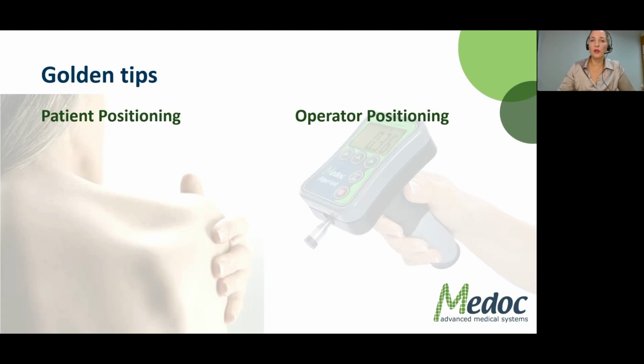Some golden tips. So again, about patient positioning. As with all QST, I want the patient to be comfortable. Have a comfortable chair for the patient. I need the patient to be concentrated on the stimulus that you're giving them, and not on the fact that because they're not comfortable, their lower back is hurting, or their hip is hurting, or they're moving in their seat. I want them to be as comfortable as possible, because otherwise they cannot be concentrated on the lab stimulus that we're giving them.